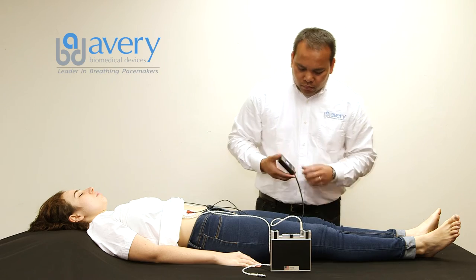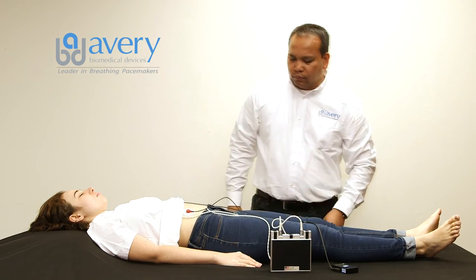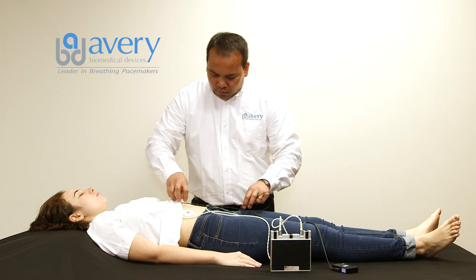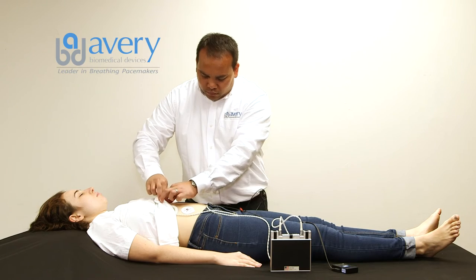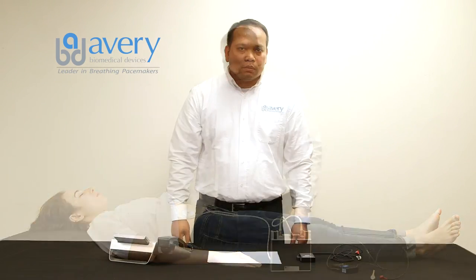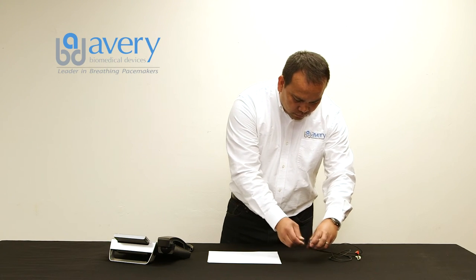Reconnect the left side antenna to the pacemaker transmitter. The recording is done. Disconnect the red and white snap buttons from the skin electrodes and remove the skin electrodes from the patient's skin. Disconnect the TTM cable from the cable socket of the TTM device.